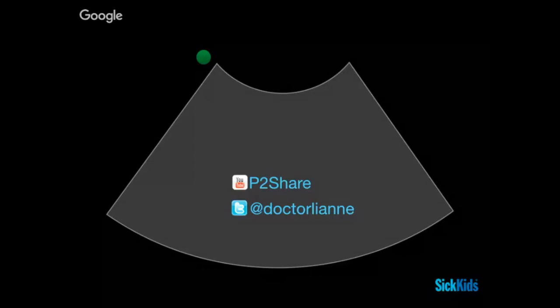So you'll look at this round structure and you'll say, oh, okay, that's a tonsil. And then you have to do that extra processing of the stuff at the top of the screen, it's the bottom of the patient's jaw. The bubbles are going to be deep in the screen, they're going to be in the lower part of the screen, but that's the top of the tonsil. So there's just that full 180 you have to do.